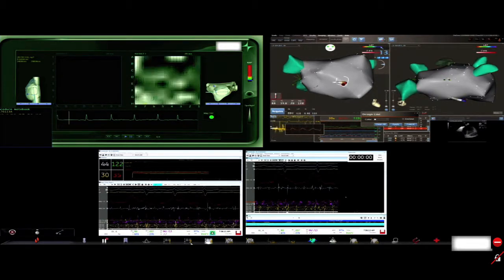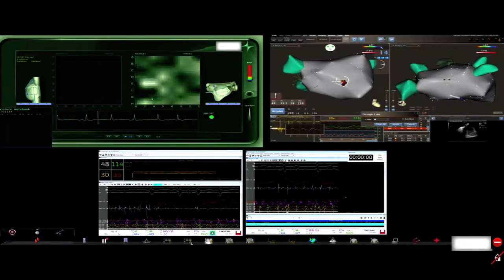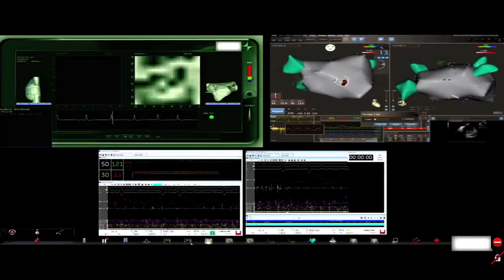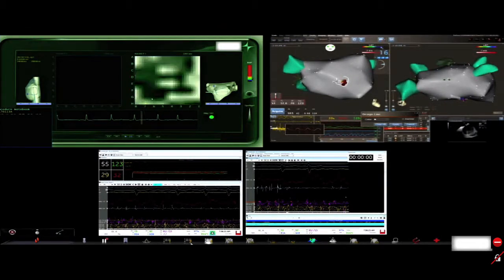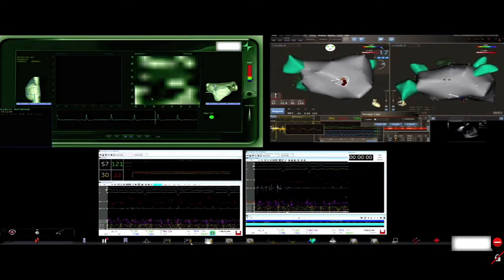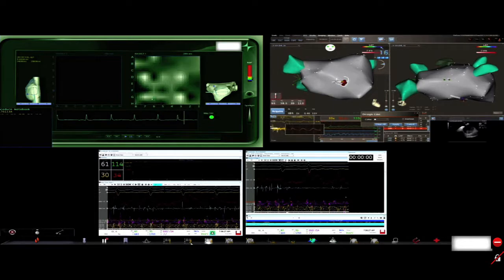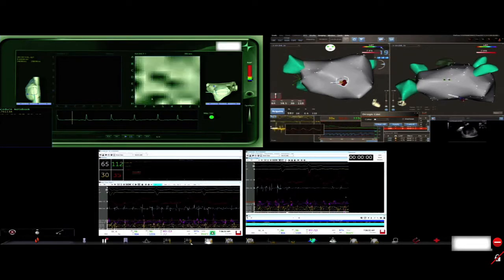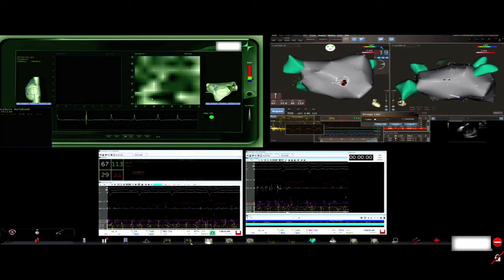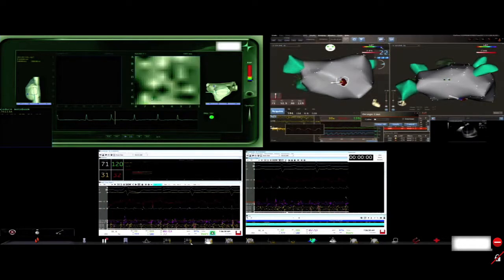Dave, do you want to talk about your strategy in ablating these regions? Are you going to fill that little square with red dots, or do you try to bring it to a structure? Yes. Typically, and we can talk about this more tomorrow, you could start with mapping in either the left atrium or the right atrium. We thought for today our strategy is to do right atrium first, then left atrium.